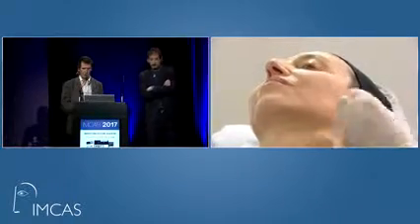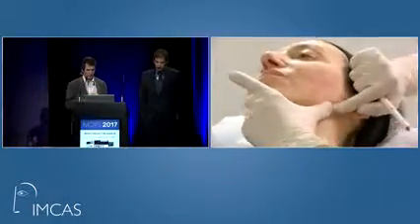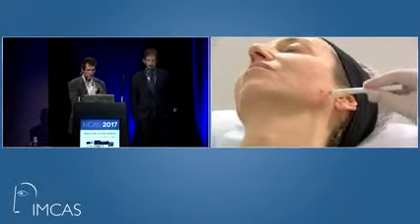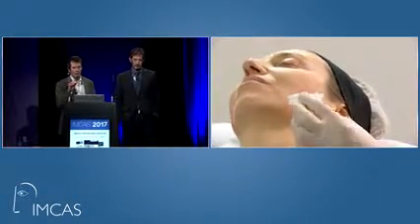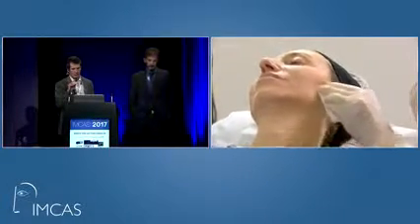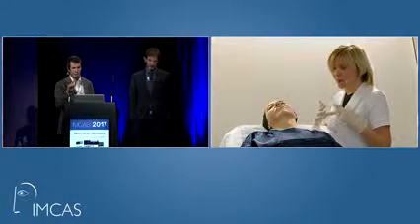Sandrine, we are back with you. So just explain to us what you did. Yes, so I will explain now what I did. I have injected on the bone, in the retromandibular angle, ultra deep on the bone, just in order to create a projection volume. Very interesting because combined with RHA4, it's very natural, and the elastic result that we have with RHA is very interesting to combine with this ultra deep.